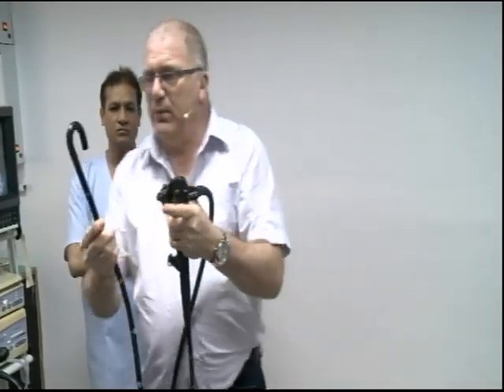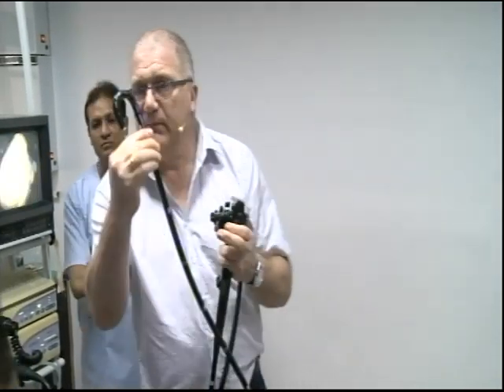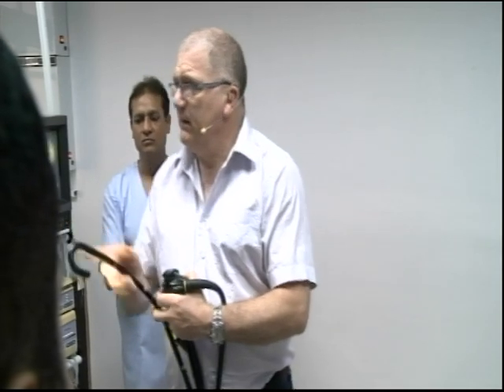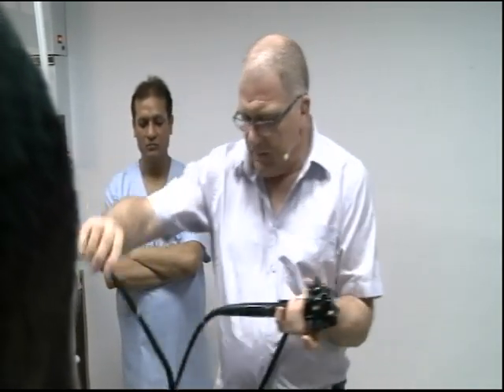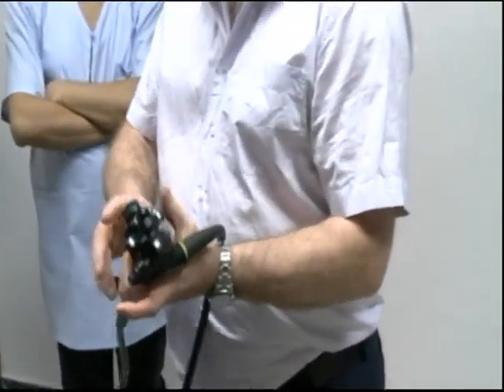The other thing is, when you pull the small wheel back, can you see how it just slightly kicks off to one side? So now when you rotate, you're leading with this edge, so you go clockwise torque, you're leading with this edge rather than this edge. So when both wheels are drawn back, it is always a clockwise torque to lead with this. Okay, so what's the importance? The importance is knowing what the scope can do. The little wheel will be used very, very little.